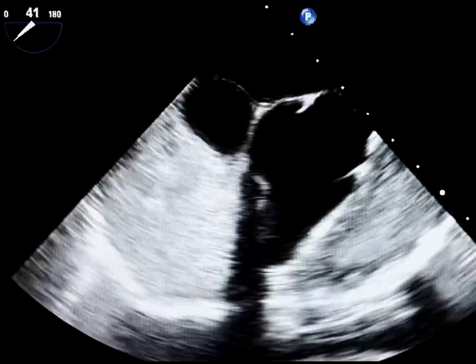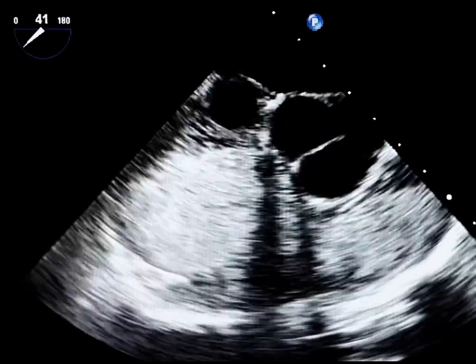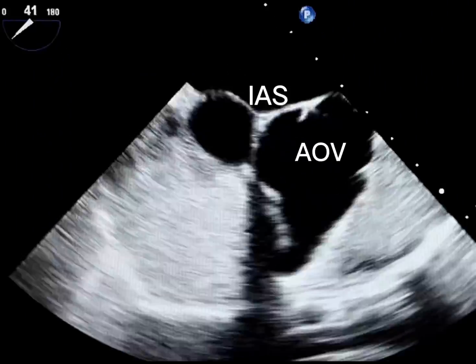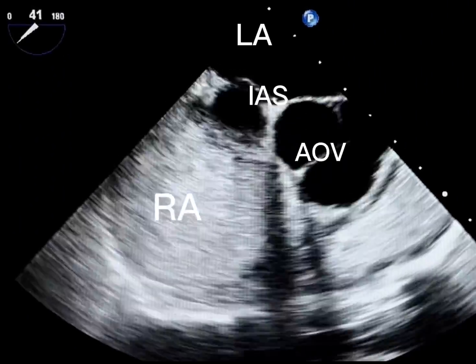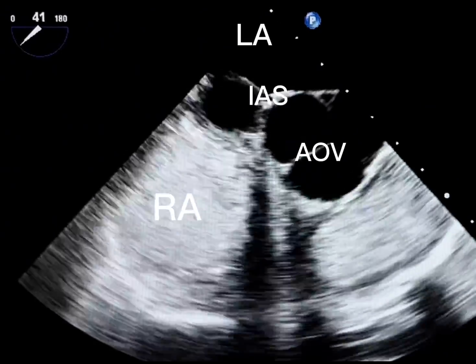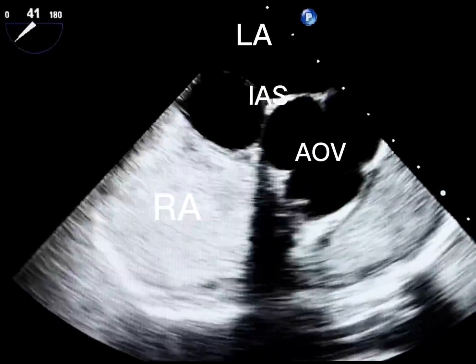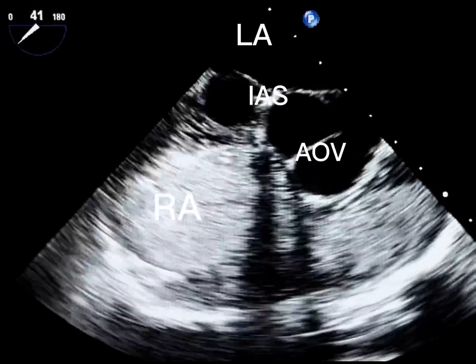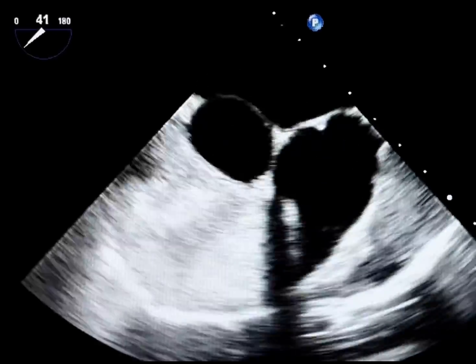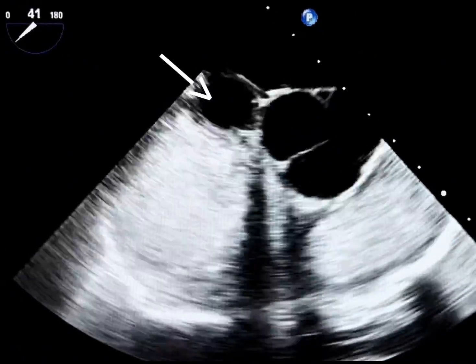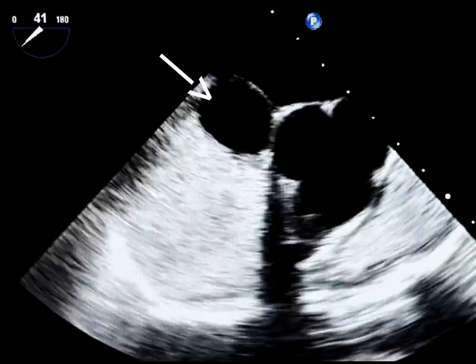This contrast study helps rule out an ASD. In fact, the presence of continuous flow should raise suspicion of an issue related to coronary artery. The large echo-free structure is indeed a coronary artery fistula.